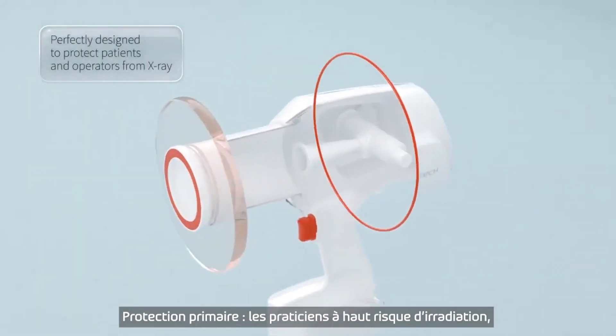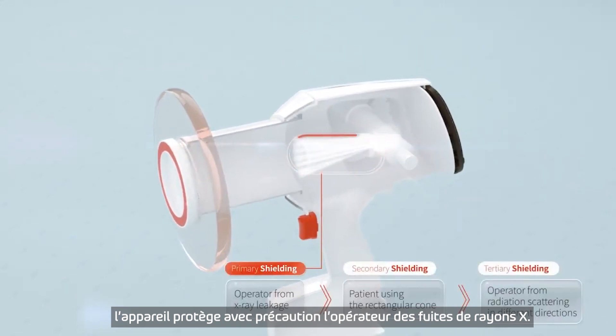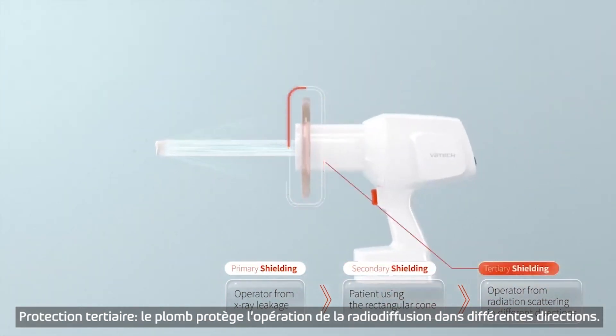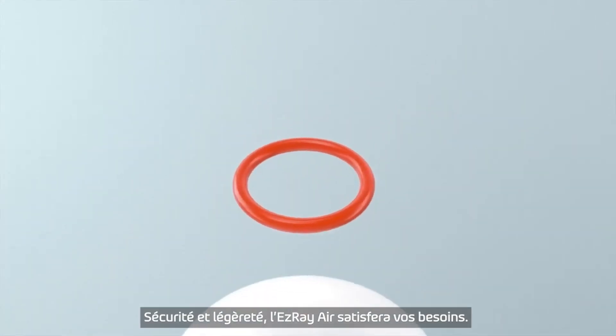Are operators at a high risk of radiation exposure? It carefully protects the operator from x-ray leakage — the patient using the rectangular cone, and the operator from radiation scattering in different directions. Light, but safe.